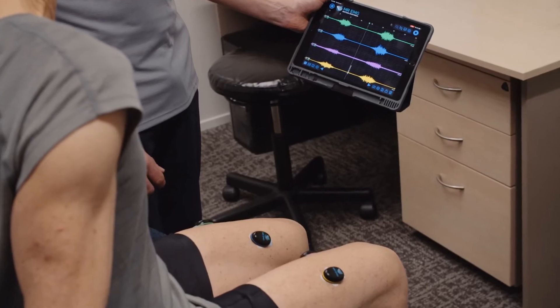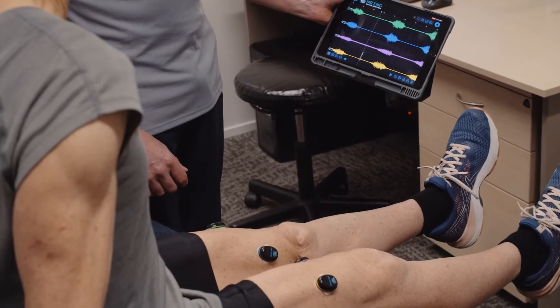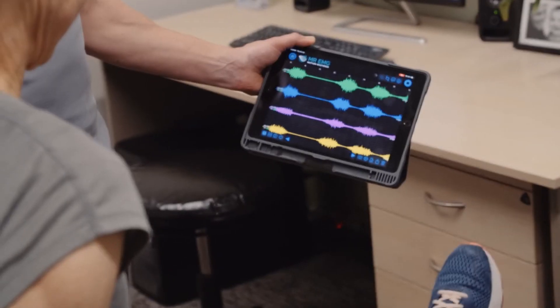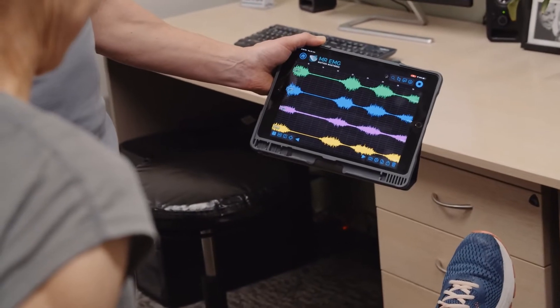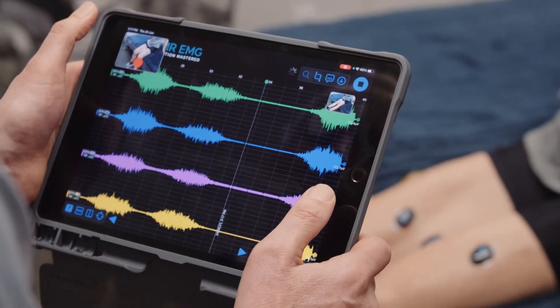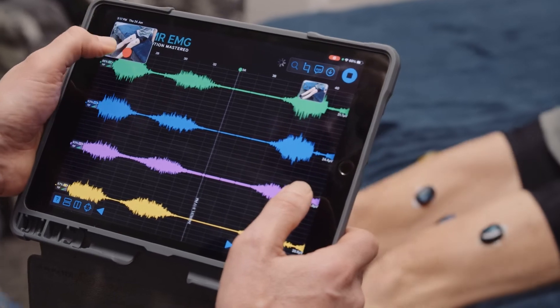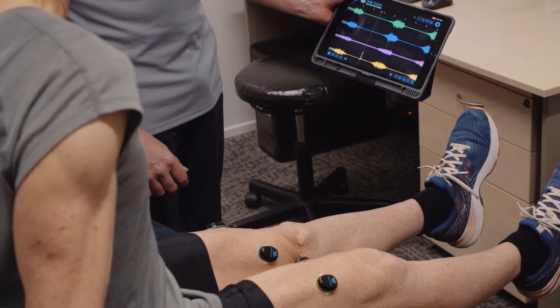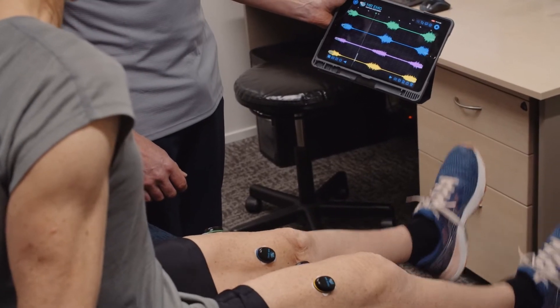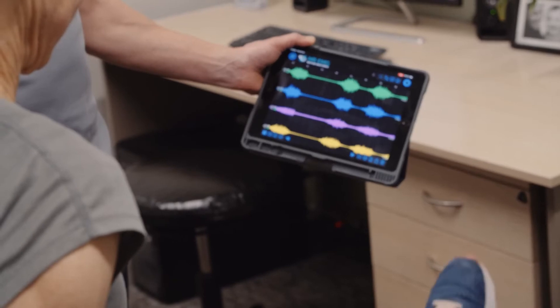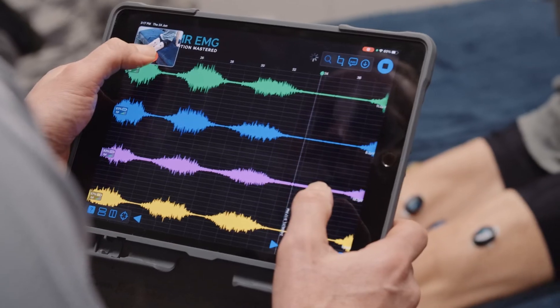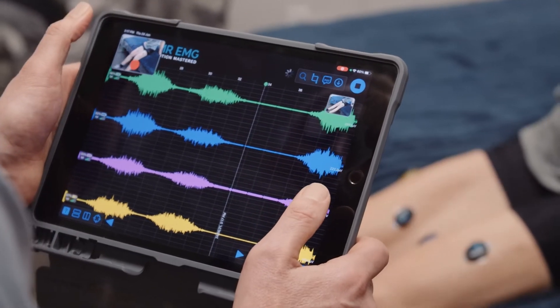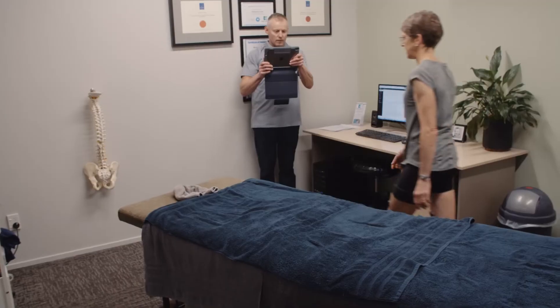Show your subject how to perform a maximal voluntary contraction of the quadriceps by way of seated leg extension using Mr. EMG biofeedback. Now record your subject performing three maximal voluntary contractions of their quadriceps muscles. Ensure you take a picture of each activity so you have an image to match your data.